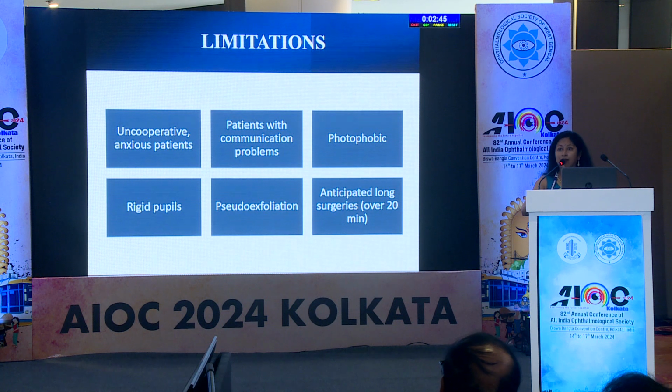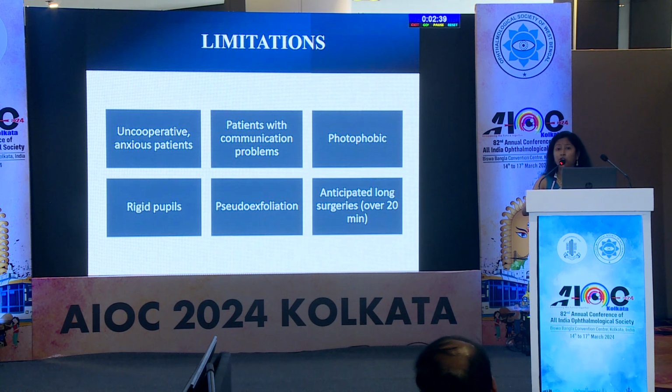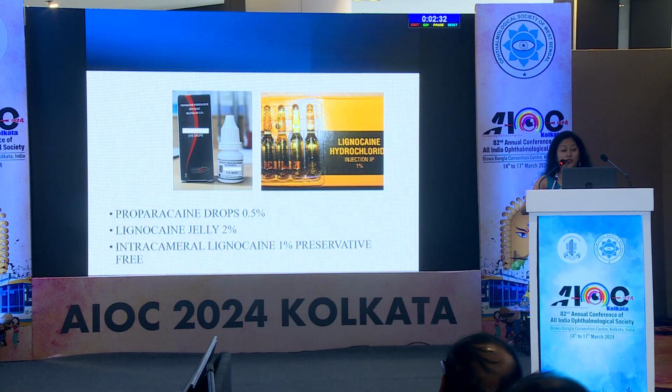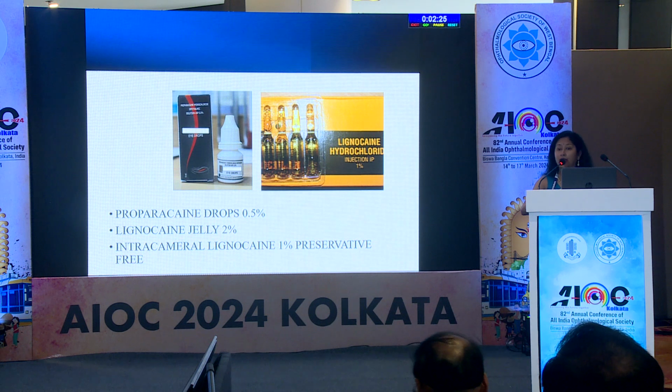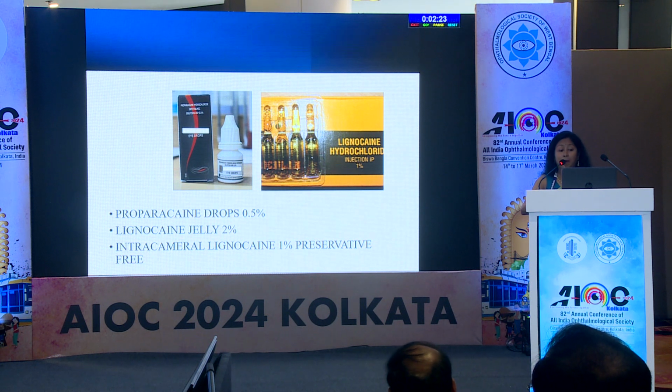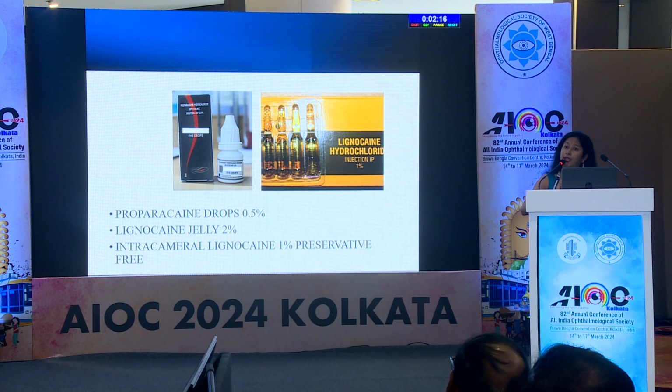But initially, yes, there are limitations. You have to choose cooperative patients and easier cases in the beginning. Avoid it when you anticipate a long surgery or a complicated case. For me, it's always proparacaine drops. I have never used lignocaine jelly, but they do help us at times, and most of us prefer to use it. Intracameral lignocaine nowadays works wonderfully. We have intracameral injections that work with your dilatation and help with anesthesia.